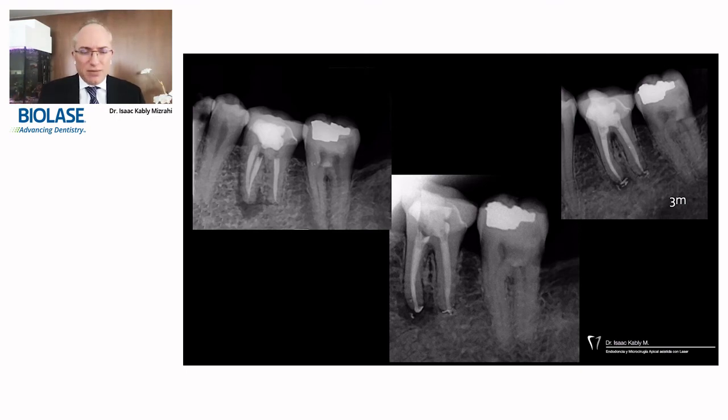Again, I don't use any chemicals inside the root canal. I do not prescribe any painkillers or antibiotics for these treatments. And the outcome is great. Patients are really happy.